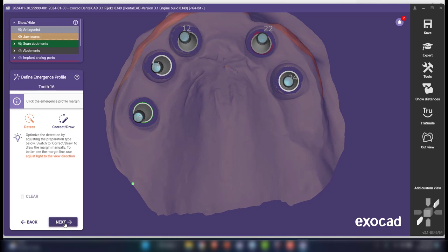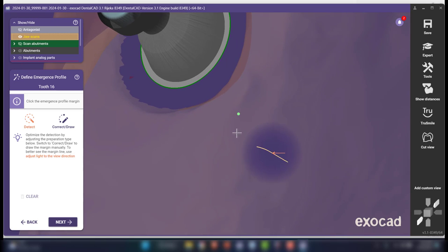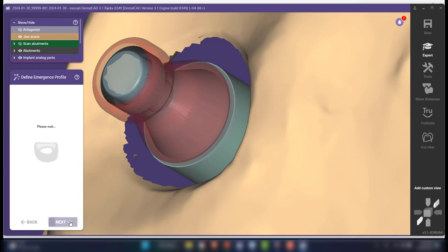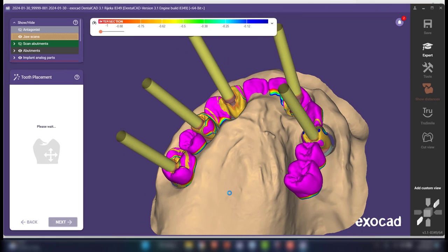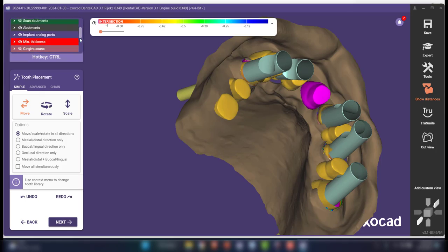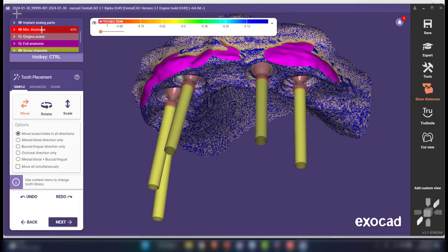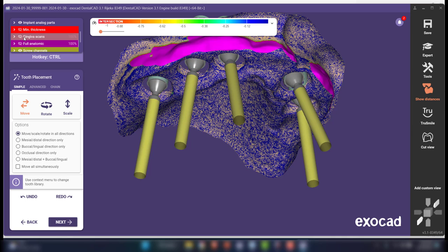All right, this is just asking us to indicate the emergence profile, and it's going to default right here to the multi-unit, which has been aligned. So I'm going to just click next through all of these. And now you would have your tooth models come in. So based on what we just completed, that has lined up our multi-unit analogs. It's lined up all of our prosthetic components, our minimum thickness spacers. All of that stuff is going to be lined up here, and we would be ready to proceed with this.